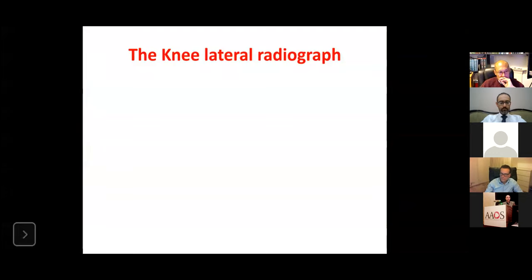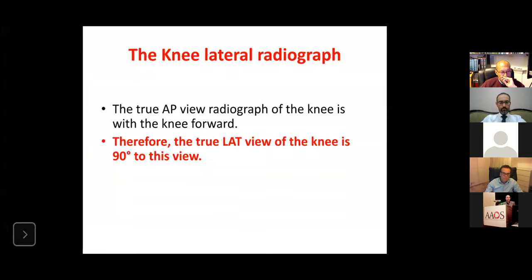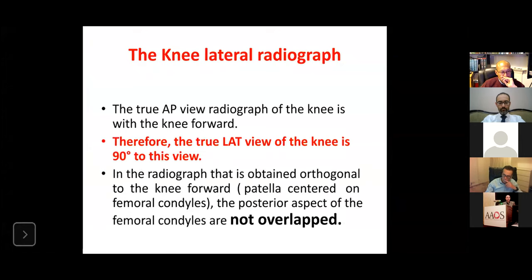We finished now the anteroposterior radiograph for the ankle, knee, and hip. For the lateral radiographs, for the knee, it is 90 degrees perpendicular for the first one. This is easy to be done. A simple landmark that this position is right.